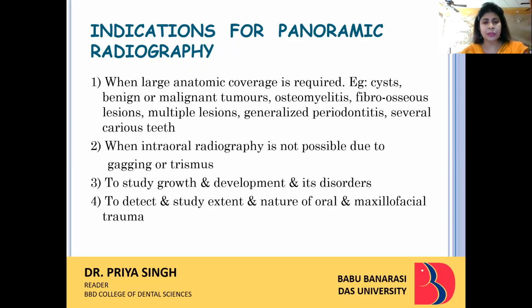Patients who are suffering from trismus. Trismus is nothing but inability to open the mouth, so it is very difficult to place the intraoral film inside the oral cavity. In such cases, panoramic is indicated. Also to study growth and development and its disorder. Usually in cases of ortho and pedo patients, it's very important to identify the mixed dentition stage and when the permanent teeth will erupt. In such cases, panoramic radiography will be very beneficial.